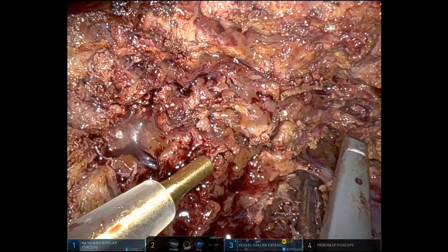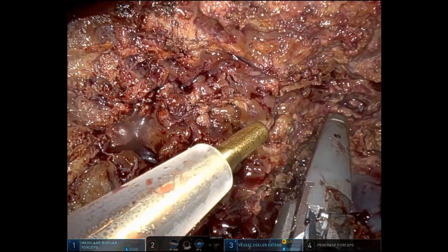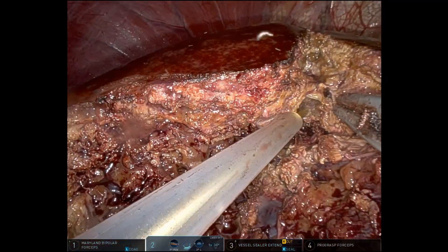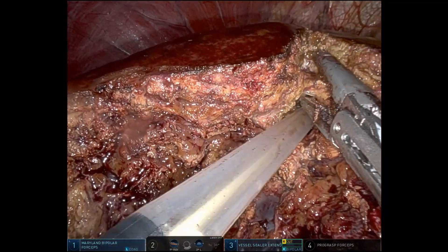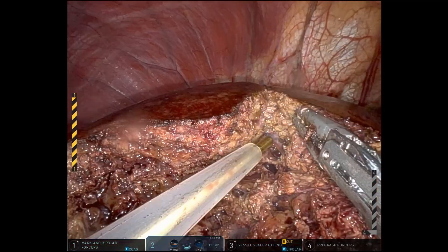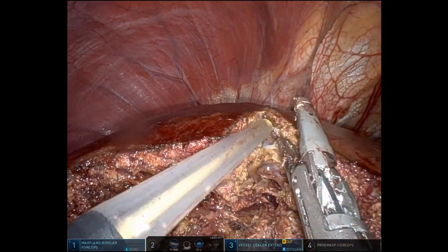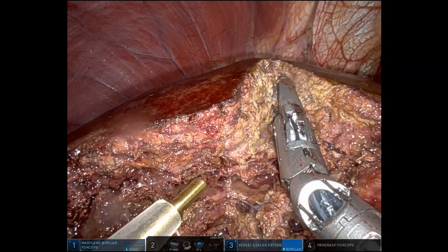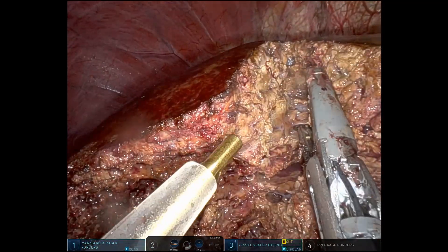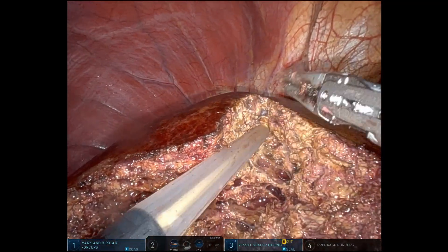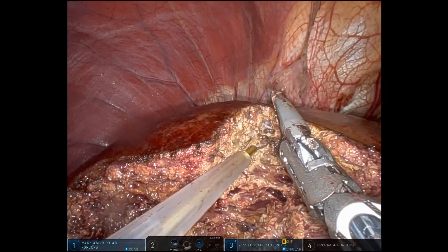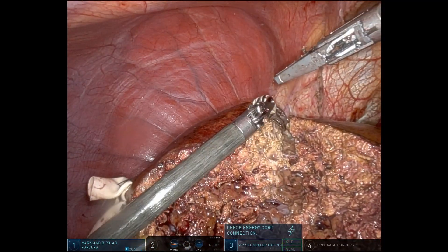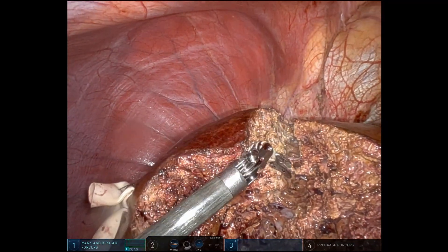You can see the middle vein in the picture there. We're just staying on the patient's right side of that middle vein. Here's a small segment 4A drainage vein that we're dividing. When we do the Pringle maneuver, we go on Pringle for 15 minutes and then 5 minutes off to allow the liver to perfuse, and continue to repeat. Here's some Maryland just using some pinch burn — you didn't see it much in this video but that's also a technique that we utilize.